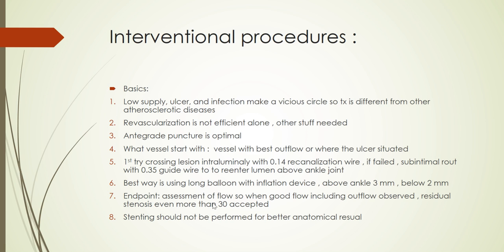For the procedure, we prefer antegrade puncture, and the vessel we start with is usually the vessel with best outflow, or where the ulcer is situated.